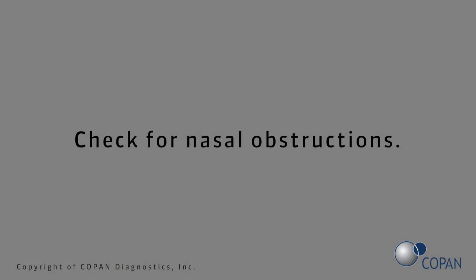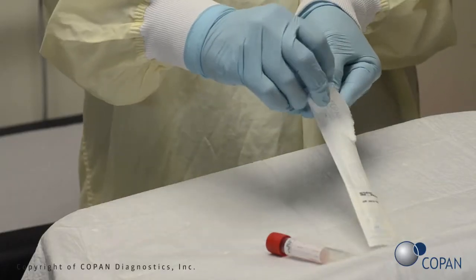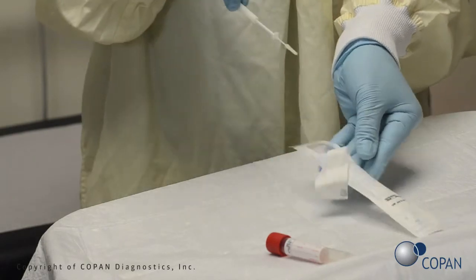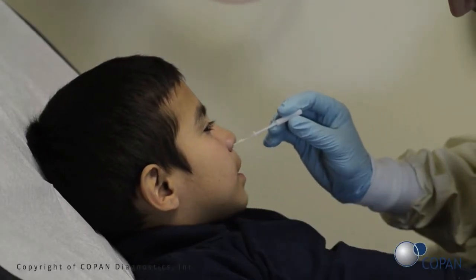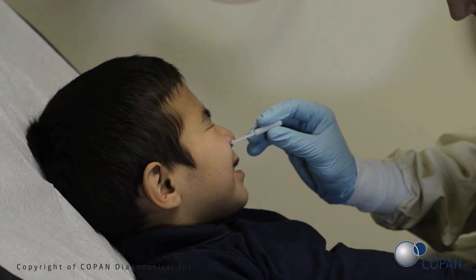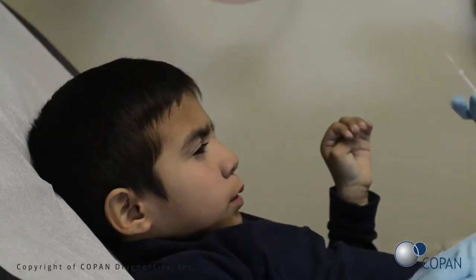Check for nasal obstructions. Open swab package. Gently insert the swab into the nostril. Using a gentle rotation, push the swab until the stopper meets the patient's nose and a slight resistance is met at the level of the turbinates. Rotate the swab several times against the nasal wall.